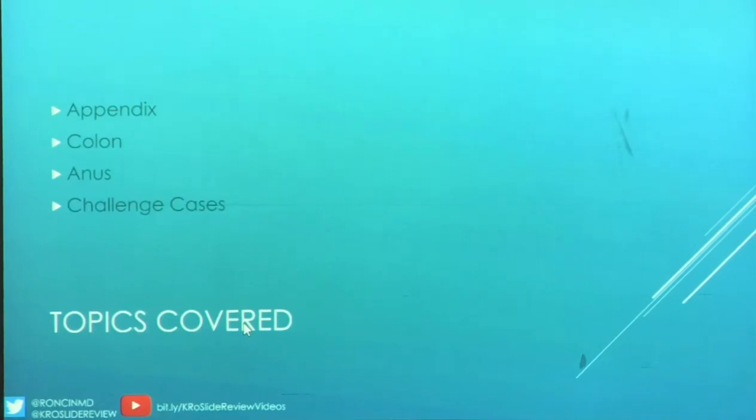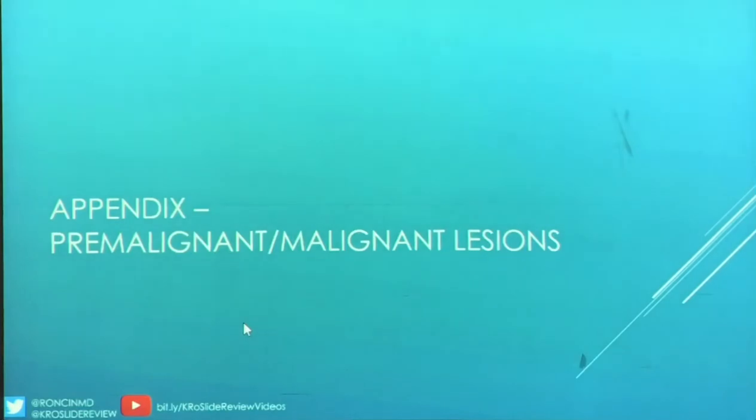So we are going to start with the appendix. Premalignant and malignant lesions. Well, spoiler alert, everything today pretty much is premalignant, malignant lesions. There may be one or two surprises in there. And this is case 1.